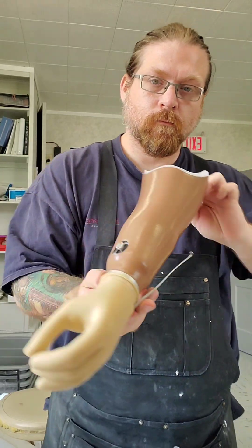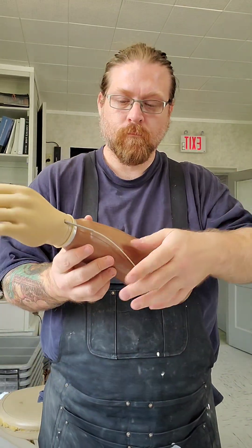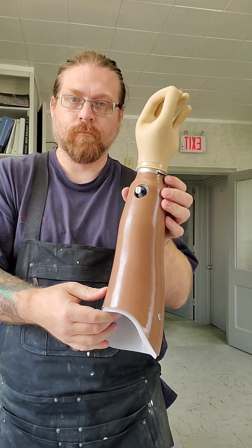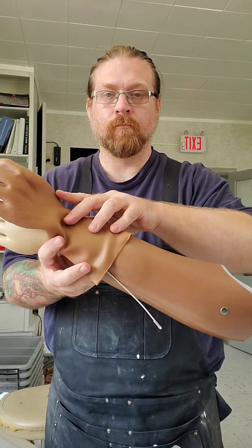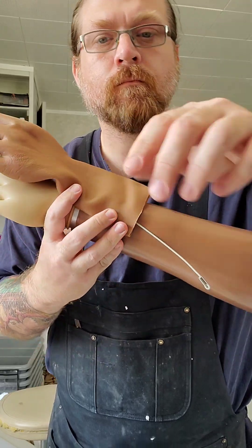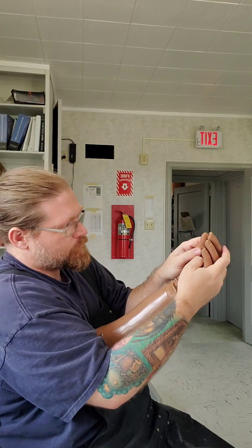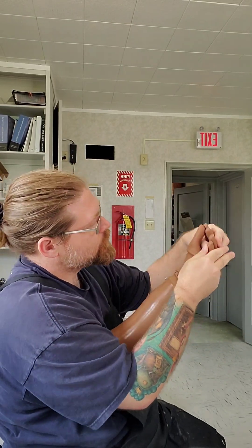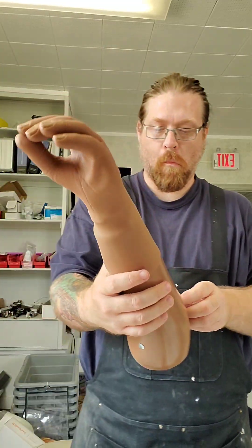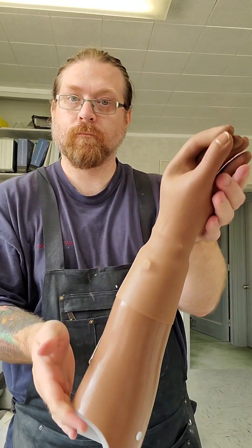I'll test out the wrist and the hand to make sure everything's working. That's going to attach to the harness, which will go around the shoulder — a figure nine harness. There's the cosmetic glove to go over that — that's what I color matched to, and I think I got pretty close. My socket does have a little bit more of a shine to it. To work the glove into place, just a little bit of donning spray and a little bit of heat — make sure to get all the wrinkles out and everything sits nice and perfect.